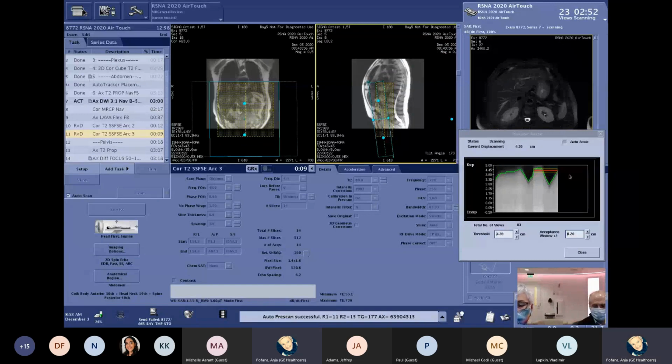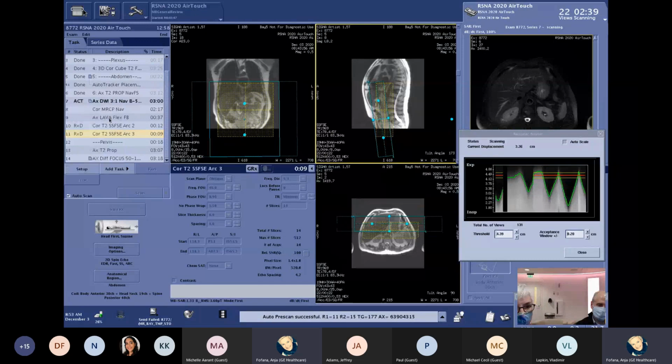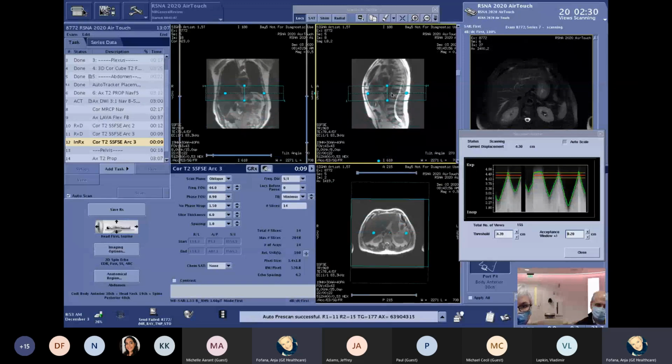And again, I have my tool here to watch the breathing pattern of the patient, and if he would change the breathing, I can immediately just change the threshold here as well. One other thing which we can talk about while this is running, we don't have to scan it, but I want to show how easy AirTouch is making your workflow here.